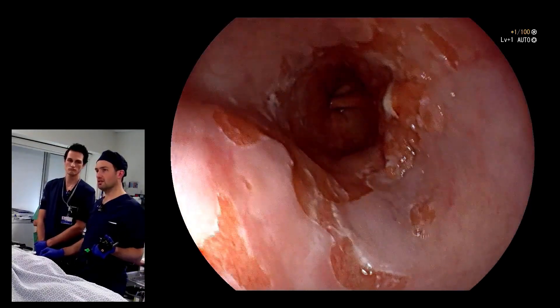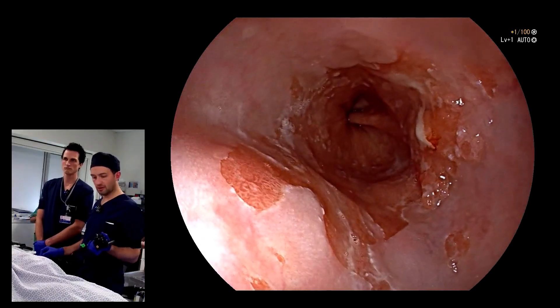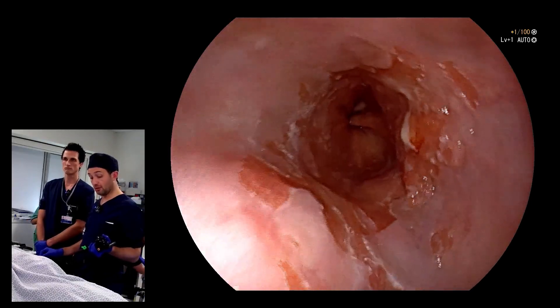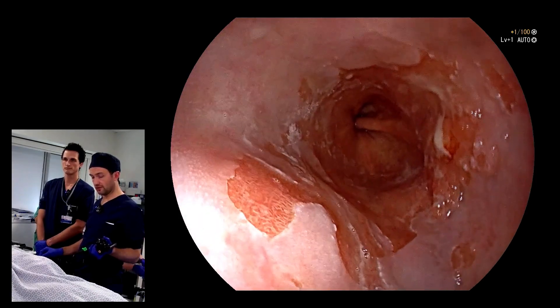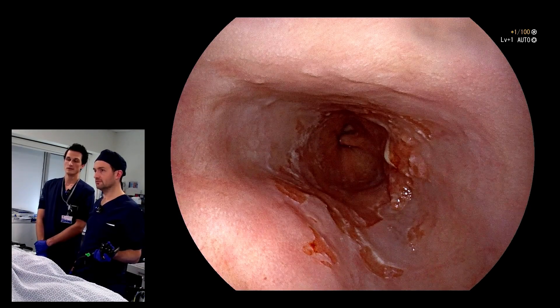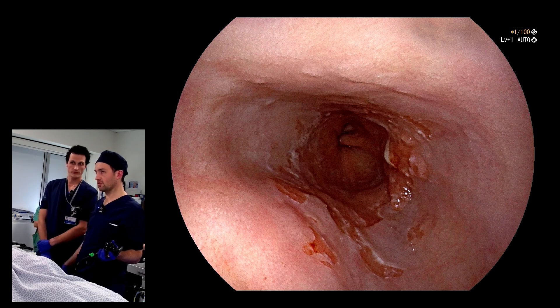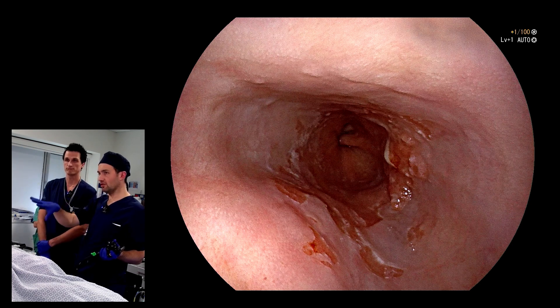This scope is real life — this is not my most super-duper endoscope ever. This is a therapeutic endoscope from Fujifilm, EG-760CT. Is this different now? To me, it's definitely different. You see something — everything is rinsed off except for something white that you can see on the 2 to 3 o'clock, which seems to be adherent to a nodular protuberance. So there's something wrong in the 2 to 3 o'clock, isn't there?